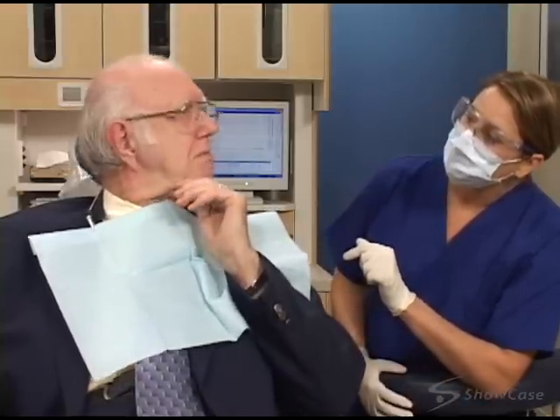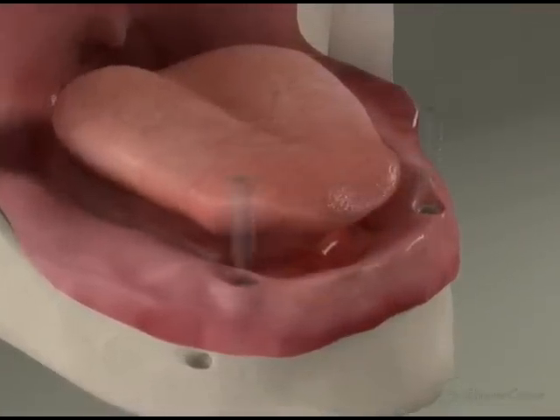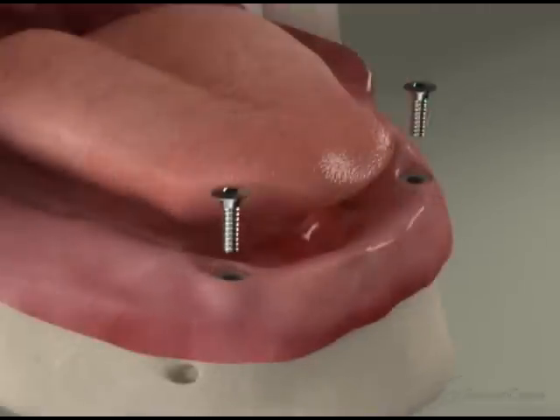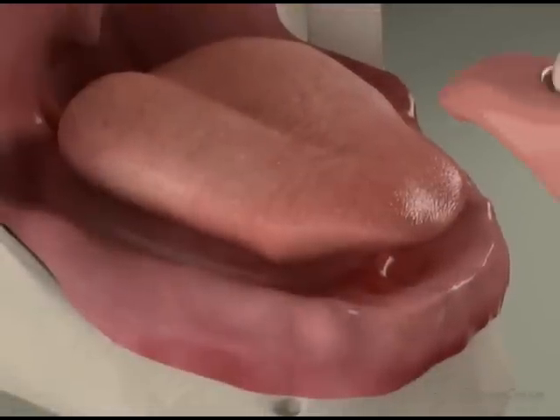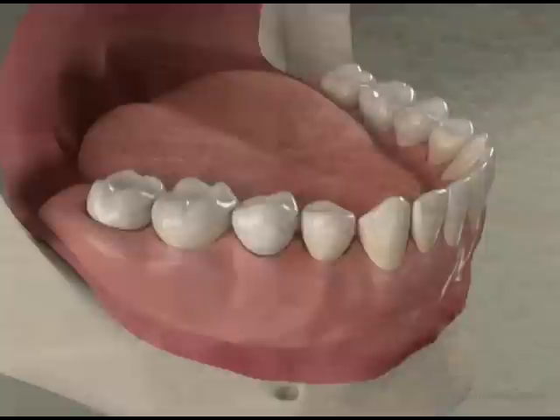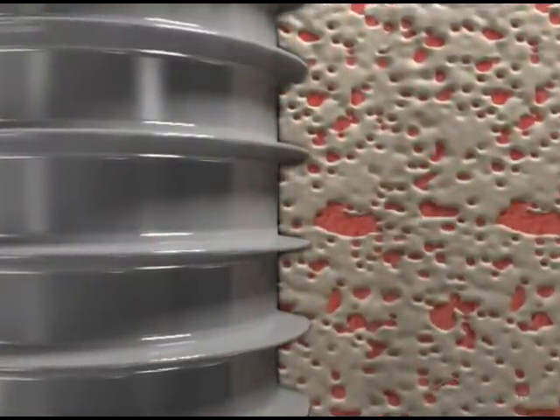Placing an implant-retained denture generally involves several phases. First, we completely numb the area to make you comfortable. Openings are made in your gums, and a channel for each implant is made in the bone. Then we place the implants into the prepared channels. Covers are placed on the implants, and the gums may be stitched closed for healing. During the healing period, you might wear a temporary denture, or your own denture can be modified to fit over the implants. Healing may take several months as the implants become securely fused to the bone.